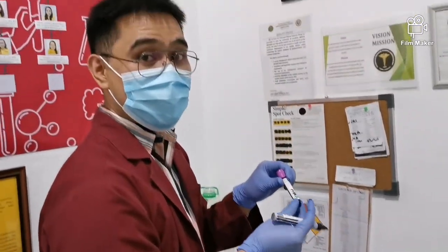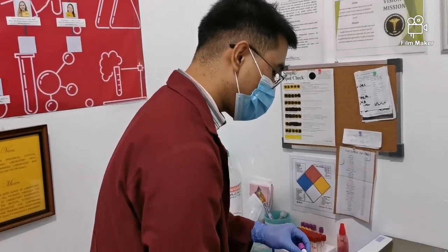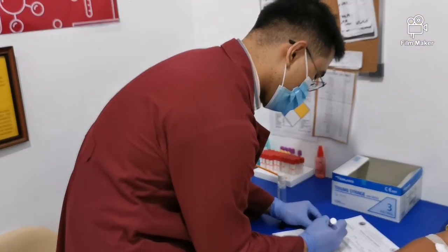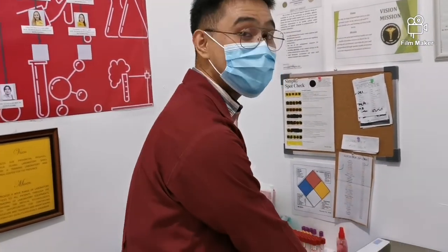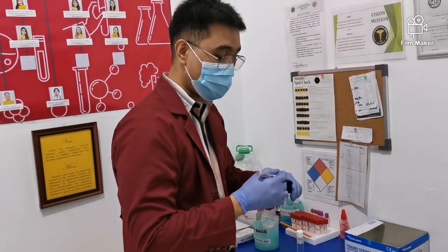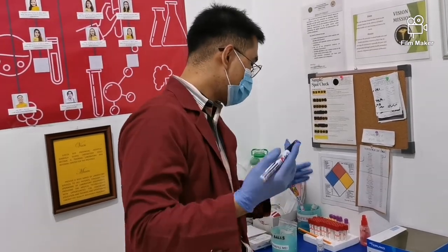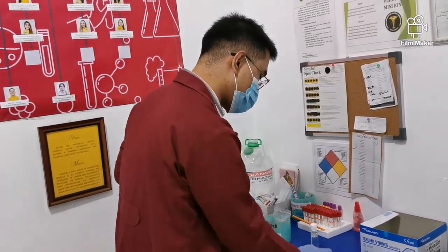And essential din na dapat ilagay mo dito sa tube natin yung birthday niya. So we ask again for the birthday. Paano ulit? Yung birthday mo, sir? So kapag tinatanong mo na rin yung birthday, dapat nagmamatch din siya doon sa request form, okay? So ano yung purpose ng pagtanong mo ng birthday? Malay mo, kapag may kapangalan pala siya, di ba? Ayun. So, for identification processes.